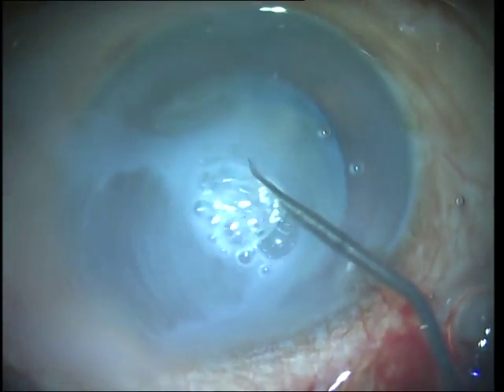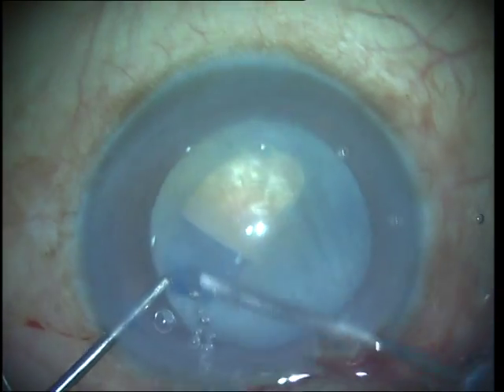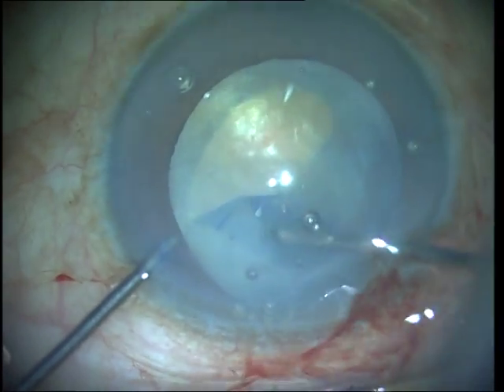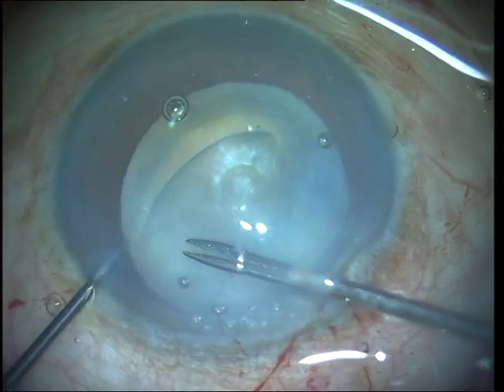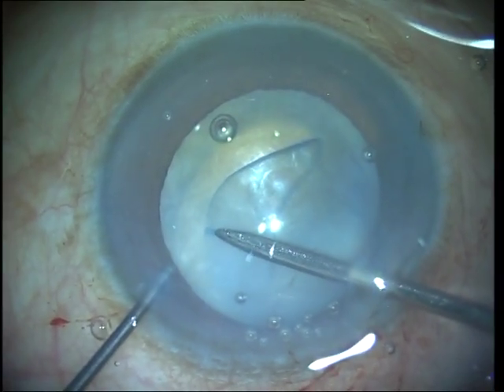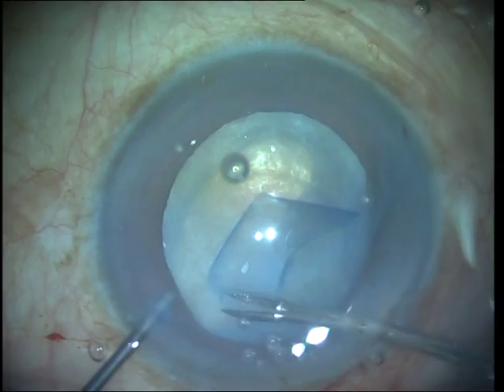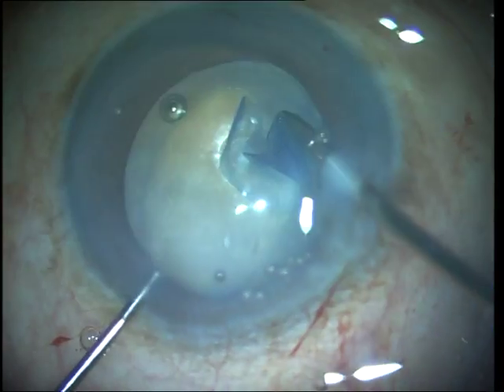You can see all of it come out. This also helps clear the view once more, and if required the anterior chamber can be washed out in order to get a clear view of the rhexis. Staining helps a lot in these cases because there is no red reflex to go by, and you may often have to shift to forceps in order to complete the rhexis successfully.